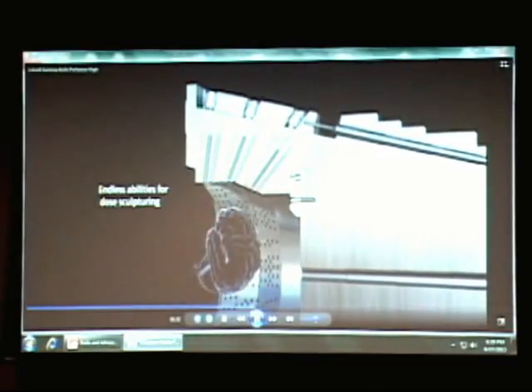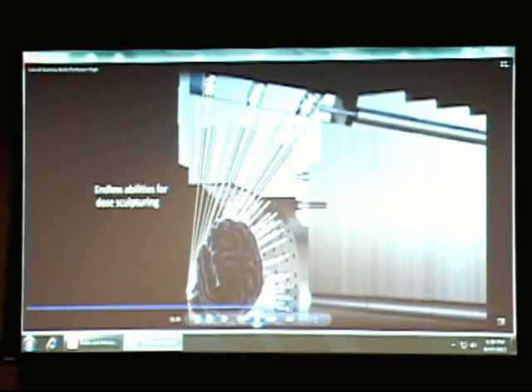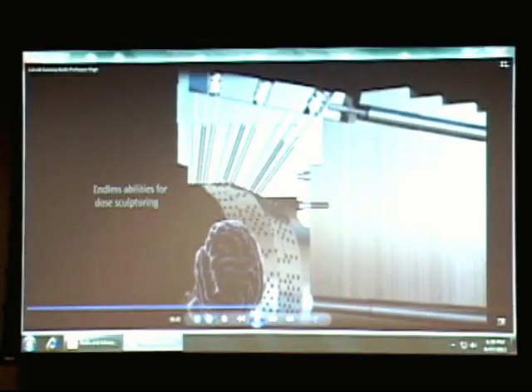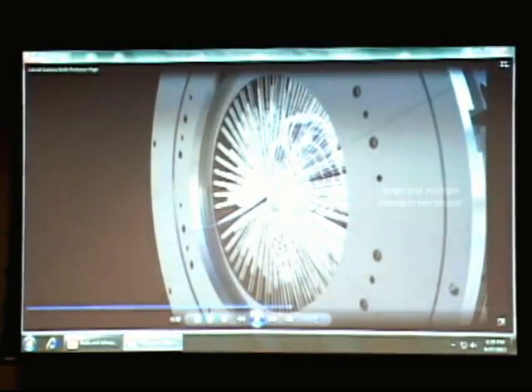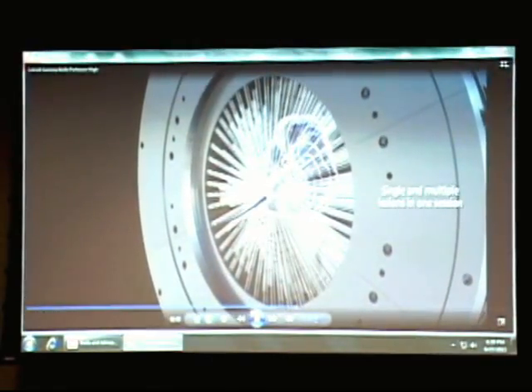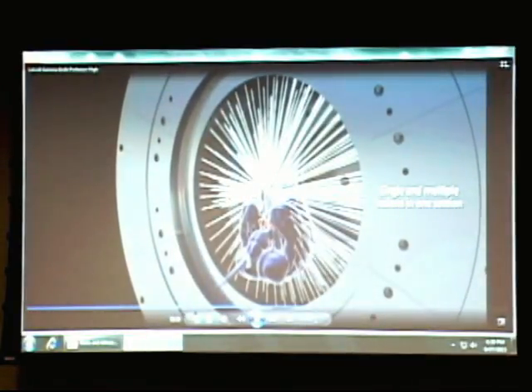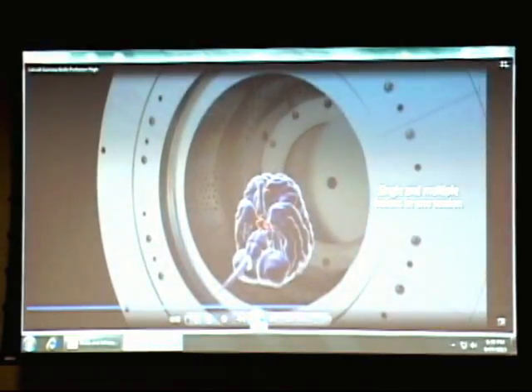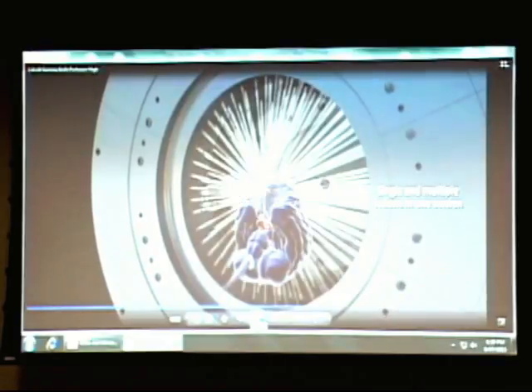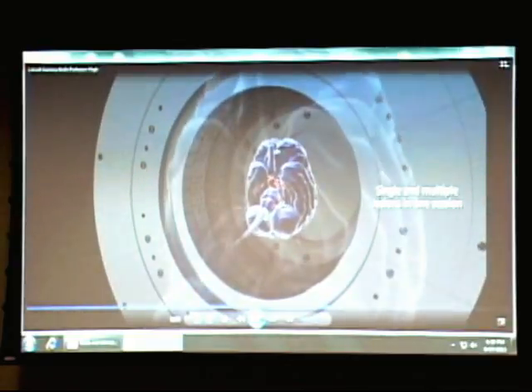So we're going to see how this all comes together in actually treating a model of a tumor here. You can actually shape these beams, which we couldn't do with the old machine. It gives us tremendous flexibility. So you can see how the different collimator sizes are up there, and all the beams, the 200 or so beams, all come together at the epicenter there. And there's a tumor right there that all these beams are focused on. And then fully automated movement to the next position.